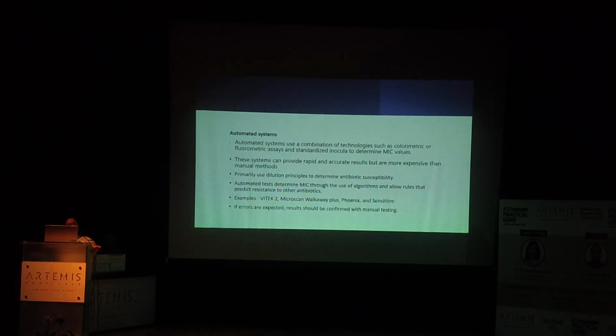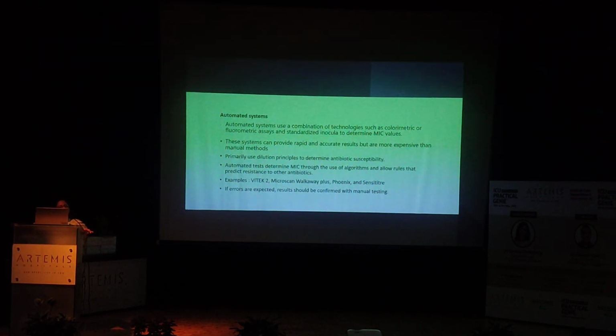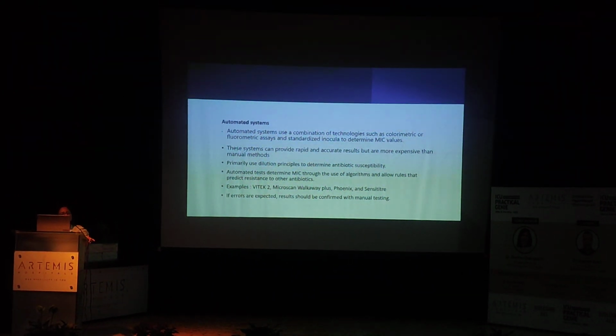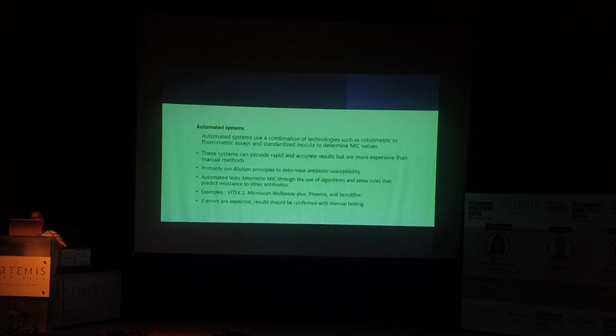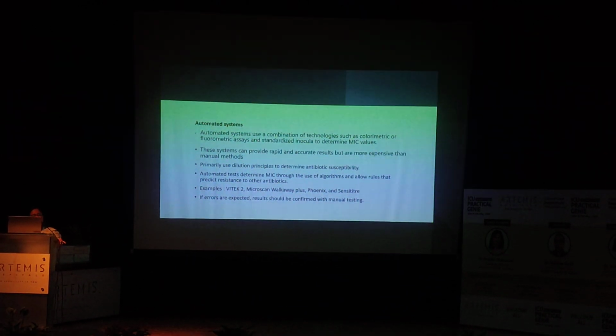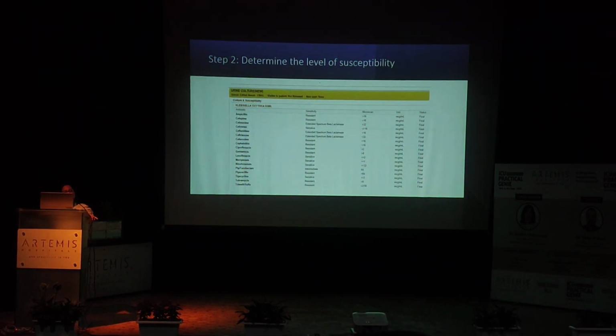Automated systems are more advanced systems. They are a combination of technologies such as colorimetric or fluorometric assays and standardized inocula, and then they determine MIC values. Examples of these are Vitek 2, MicroScan, Walkaway, Phoenix, and Sensititre. I'll come to this slide again.